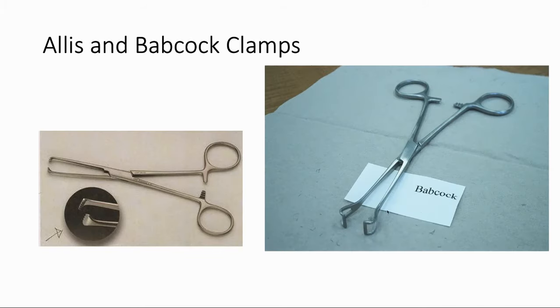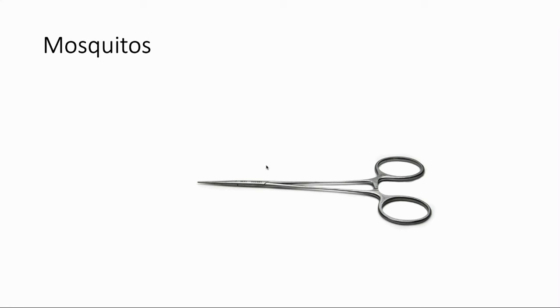These are two other clamps called the Allis and Babcock clamps. The Allis looks a little sharper and more intimidating than the gentle edge of the Babcock. The Babcock is frequently used for grabbing onto bowel, and the Allis can be used to grab onto bowel or pretty much anything else you need to grasp. And now mosquitoes — these are the light, small, delicate versions of clamps. They can be used for small vessel dissection or as a quote-unquote snap — something you snap on the end of a suture to help keep track of it and keep things organized.